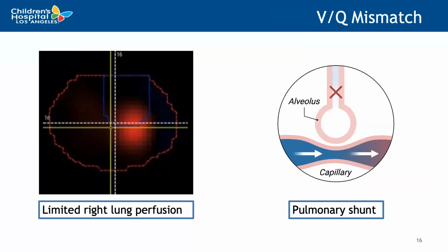This measures the amplitude of cyclic changes in the lung impedance caused by the passage of the cardiac stroke volume through the lung. The EIT belt itself has a built-in EKG. Normally we would negate the cardiac signal to get the ventilation image, but we can actually use the opposite for the purposes of looking at pulsatility and perfusion.